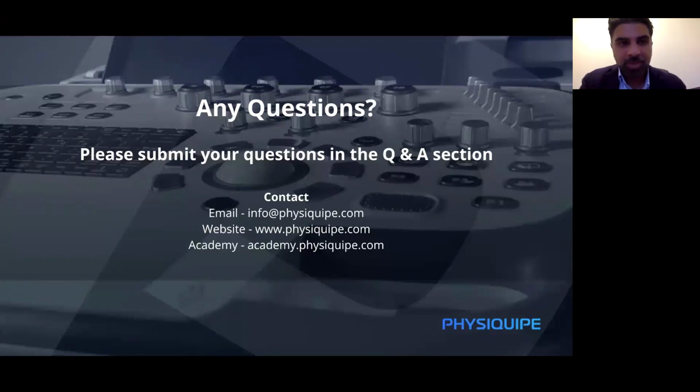So normally a rheumatology consultation for one patient is around 25 to 30 minutes. Depending on how quick you are or how competent you are, I think you can do an ultrasound within 10 minutes or so, and then it gives you a bit of time to have a discussion. So I think you're looking at 40 to 45 minutes per patient.